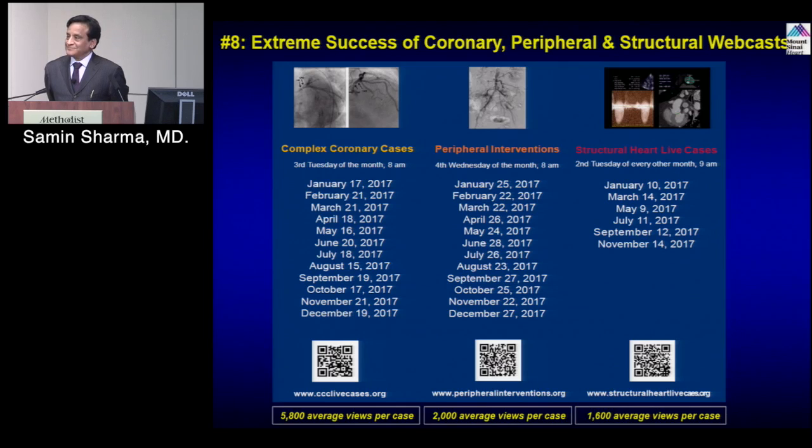I expanded the balloon. The plaque expanded. I put a 2.25 stent to cover distally. Two weeks later, I don't know the compliance with Plavix, etc. is a question in this guy, but two weeks later, that area appears unexpanded. Do you think stent recoil in these lesions, once you have expanded the stent, is a problem?